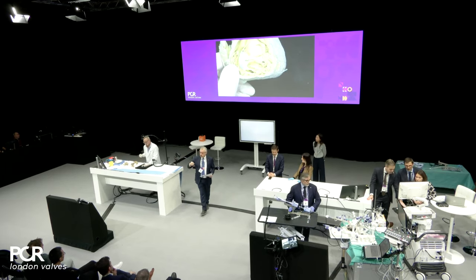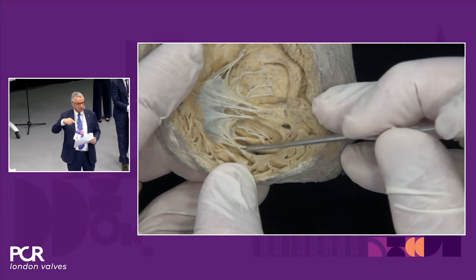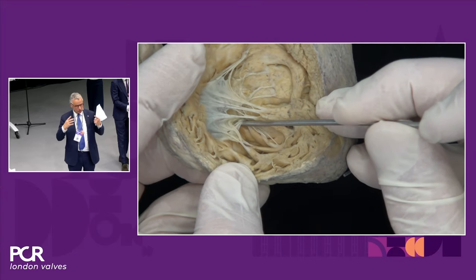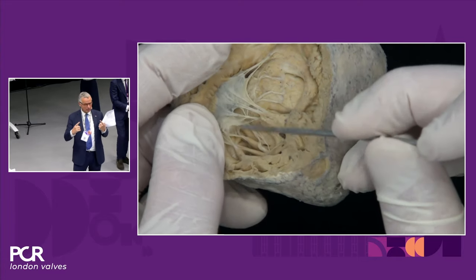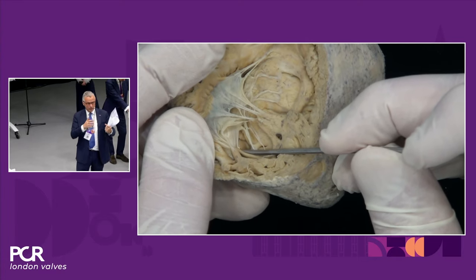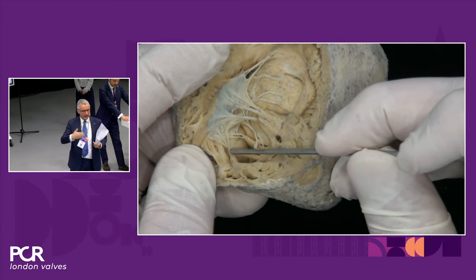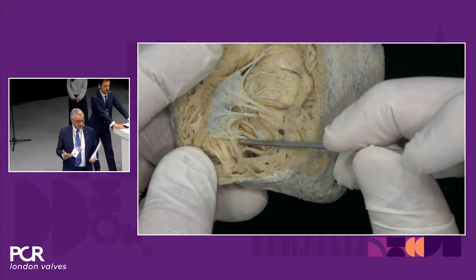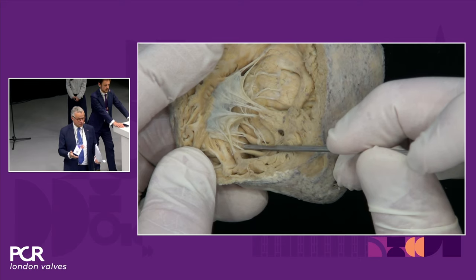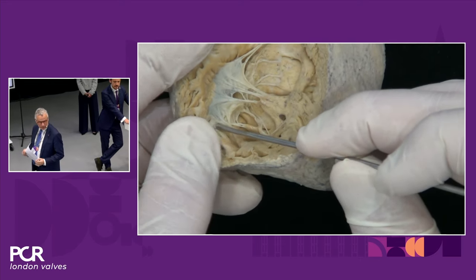Since you have a lot of papillary muscles, a lot of chordal free zones, each chordal free zone is supported by two papillary muscles. And so the line of coaptation is a very complex multiple line structure, which is making our life difficult, to be honest. That's why the easiest procedures are the ones where TR comes mainly from the anteroseptal commissure.